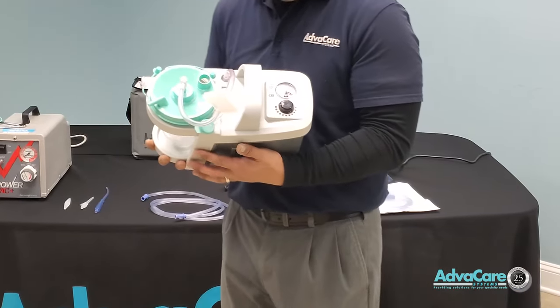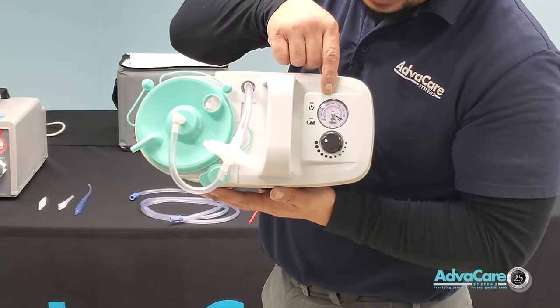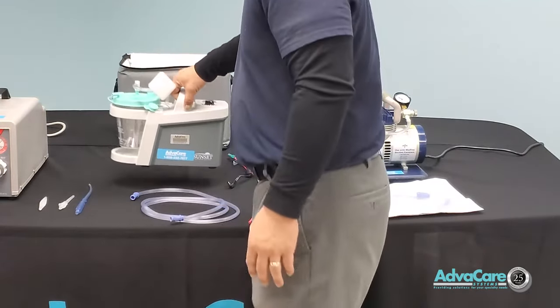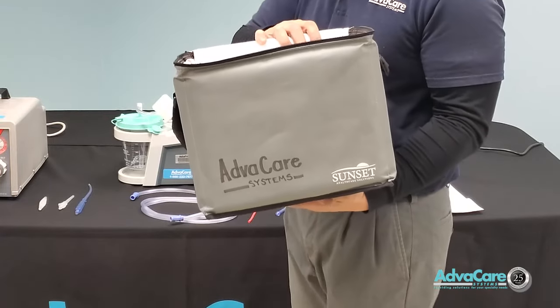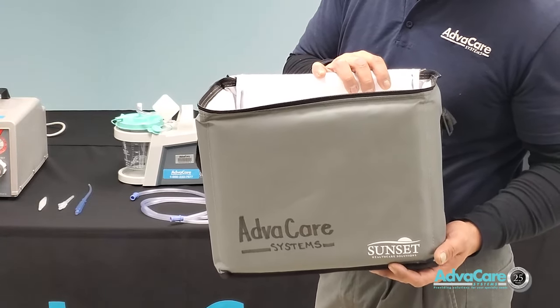You can see the dial and the gauge here, and this is the handle where you hold it from. It comes with both a portable charger for the car as well as a charger for the home environment.